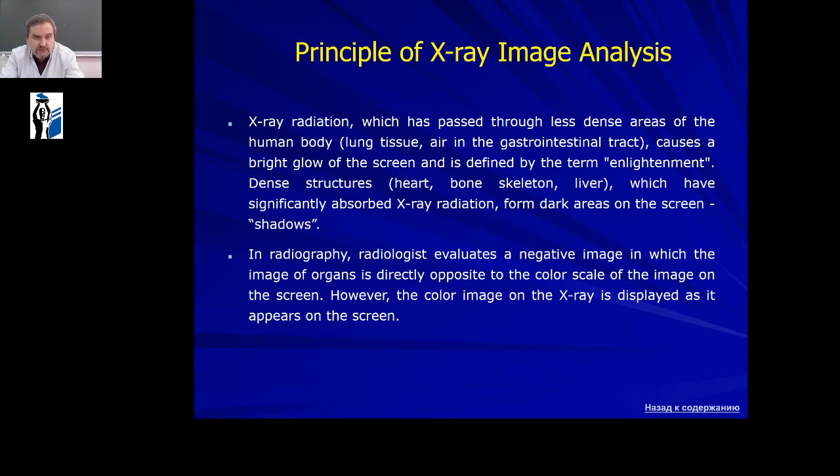Dense structures, heart, bone, skeleton, liver, which have significantly absorbed X-ray radiation, form dark areas on the screen, shadows.